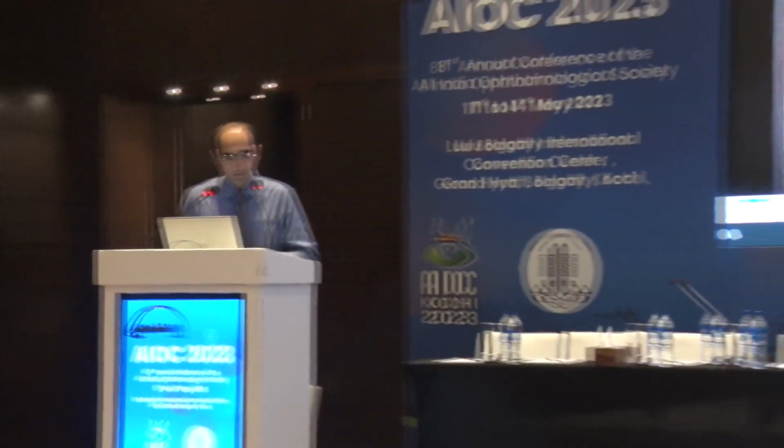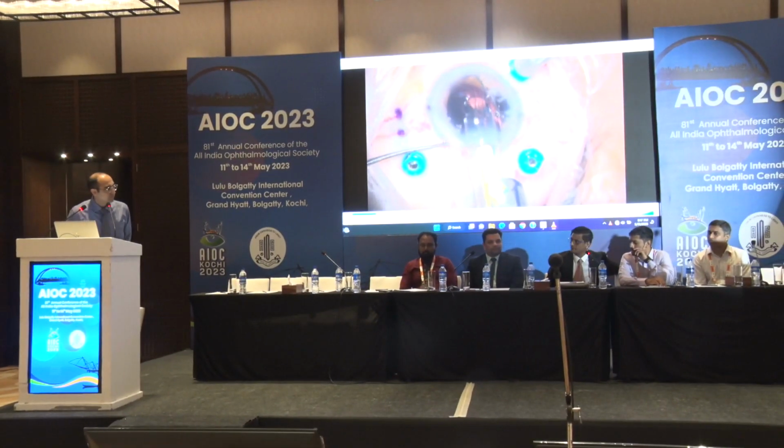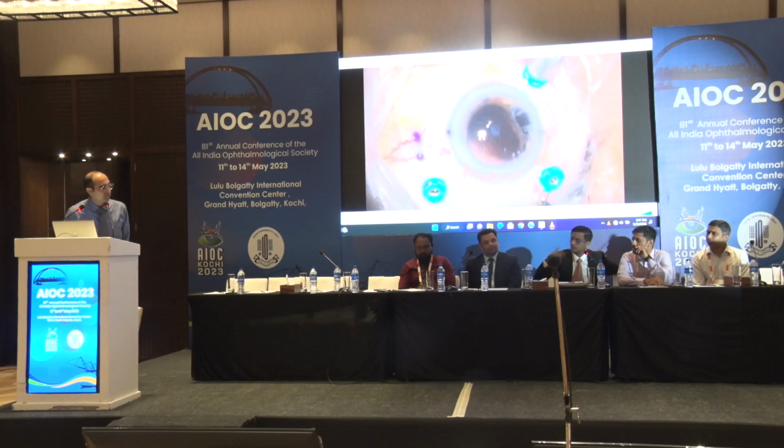My 2 cents is, I was doing Prabhu Bhaskaran's technique of docking. It is easy. You have a tunnel and you introduce a 26 gauge needle and dock it. Very nice technique, superb technique. But we did a study of our data, around 80 eyes in the last 3-4 years. And what we found was that all the patients had some astigmatism. So uncorrected vision was always less, and the patient will always complain. Then we give glasses, and they're fine, 6/6 and 6/9. So then I revisited the paper and saw what Gaber has done.